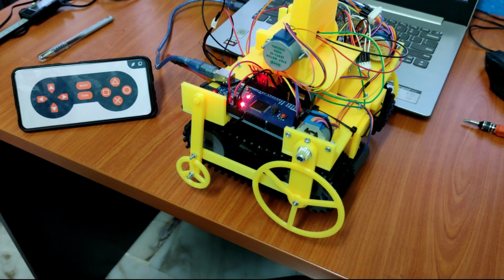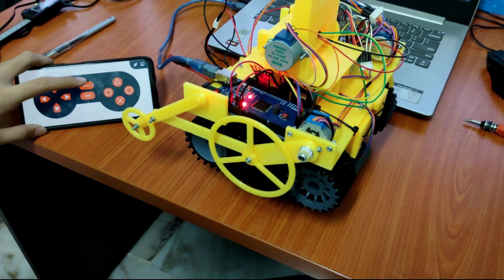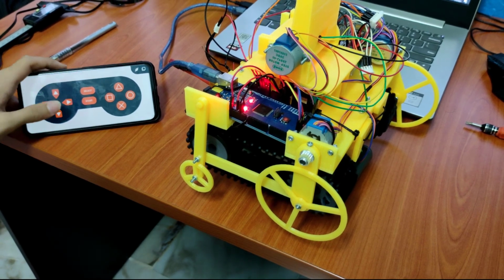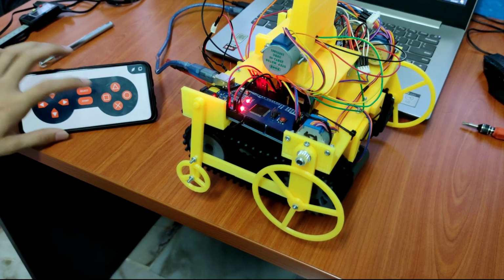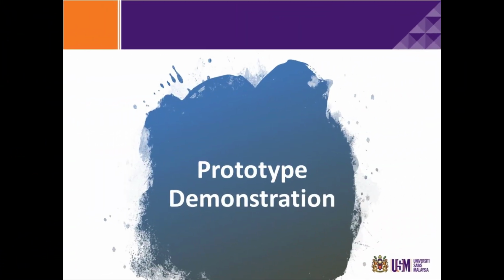Next, the transitional unit that converts the wheelchair from manual operated mode to the stair climbing mode was tested. Lastly, the track belt movement was tested. Finally, the routine of the prototype was tested.